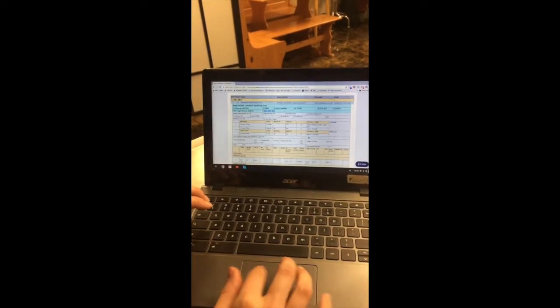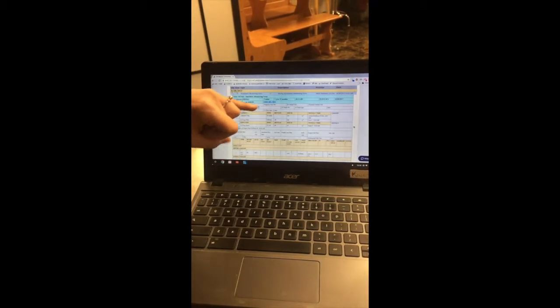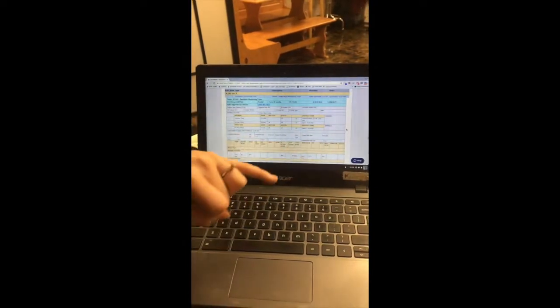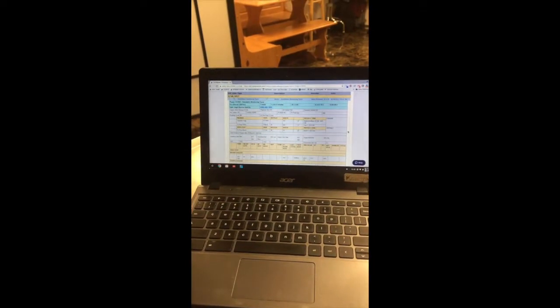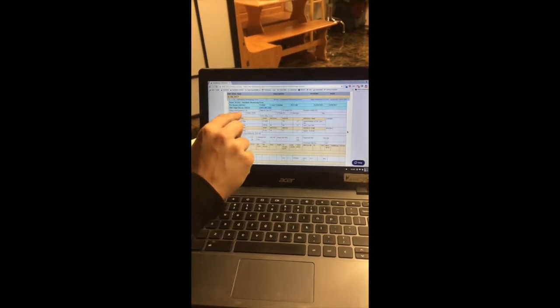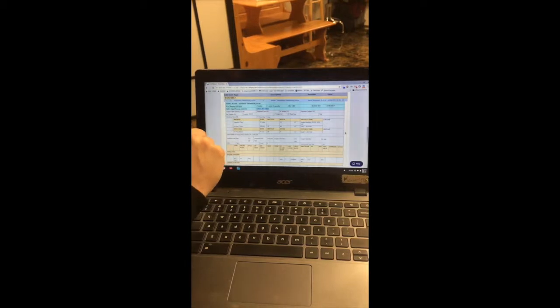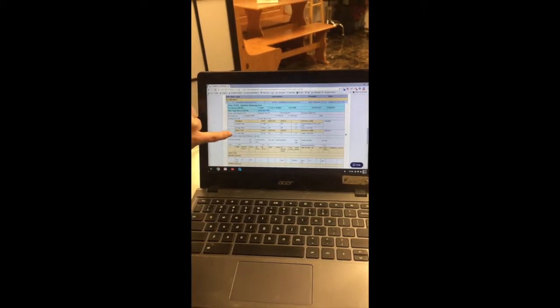We can see this gives us all the information: her name, who her owners are, and she's a rescue dog. It tells us she's a canine, how old she is, how much she weighs in both pounds and kilograms, and today's date. This also gives us all the information of who did her surgery, and whether or not we placed a catheter. We have all of her pre-meds and induction drugs here.